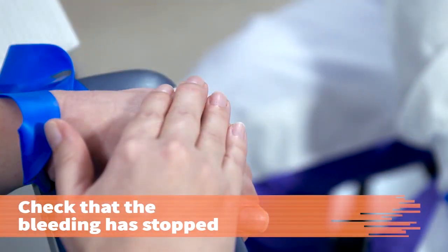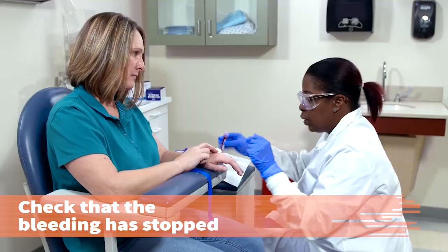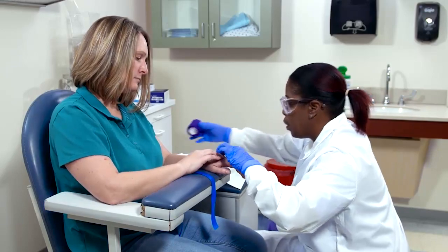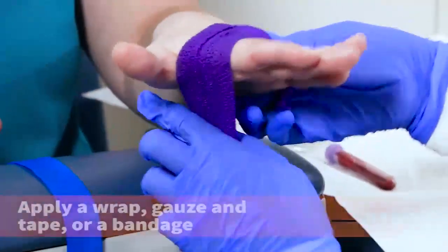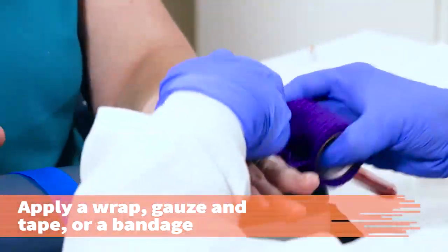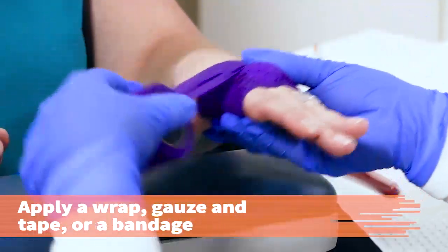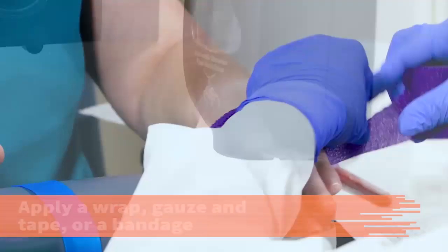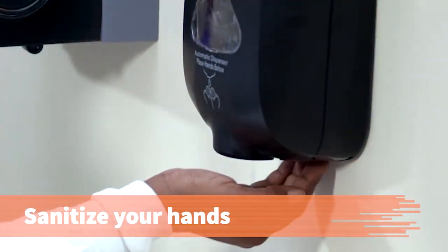Check the venipuncture site to make sure bleeding has stopped. Alright, let me take a look here. Alright, you stopped bleeding. If you can hold it for just a second, I'm going to go ahead and wrap it up. Apply a hypoallergenic self-stick wrap, gauze and tape, or bandage. Wash or sanitize your hands.